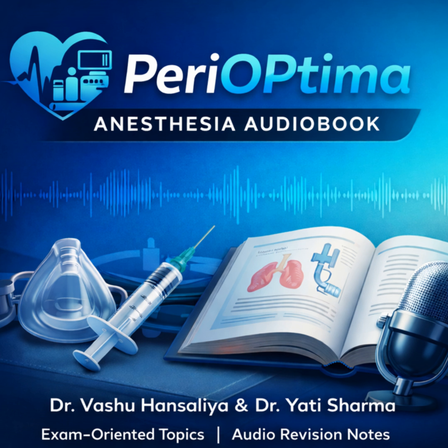Which leads to the second principle, continuous versus intermittent. I feel like we take this for granted. We do, but the examiners won't. Think about blood pressure. A non-invasive blood pressure cuff, NIBP, gives you a snapshot, maybe every 5 minutes. In a stable post-op patient, that's fine. Sure. But what about the patient on high-dose inotropes or experiencing rapid hemodynamic shifts? 5 minutes is an eternity. Exactly. In 5 minutes, a patient can have a major event. An arterial line gives you beat-to-beat analysis. You see the pressure drop instantly. That's the argument for going invasive.